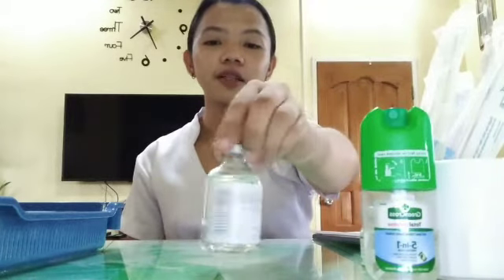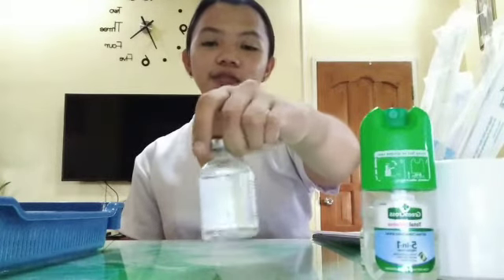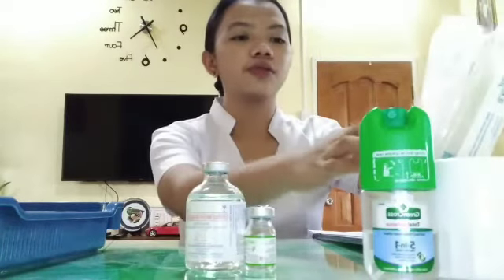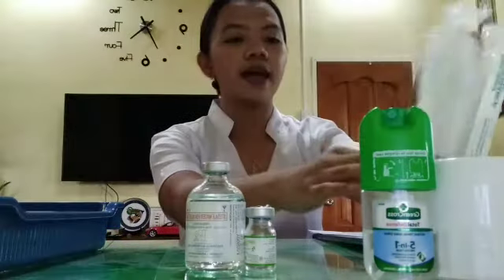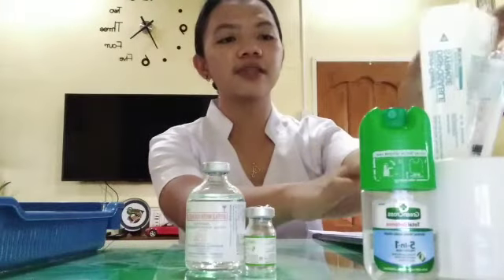I will be using the sterile water for injection, the ampicillin, the 2 aspirating needles, dry cotton balls here, and 2 5 ml syringes, and 1 tuberculin syringe.